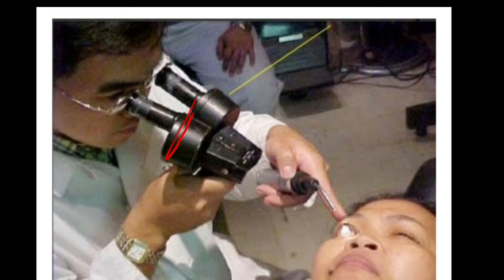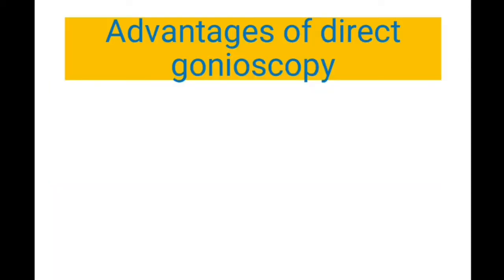Okay, so what are the indications for this direct gonioscopy? It is mainly done in the pediatric age group. So what are the advantages of direct gonioscopy?